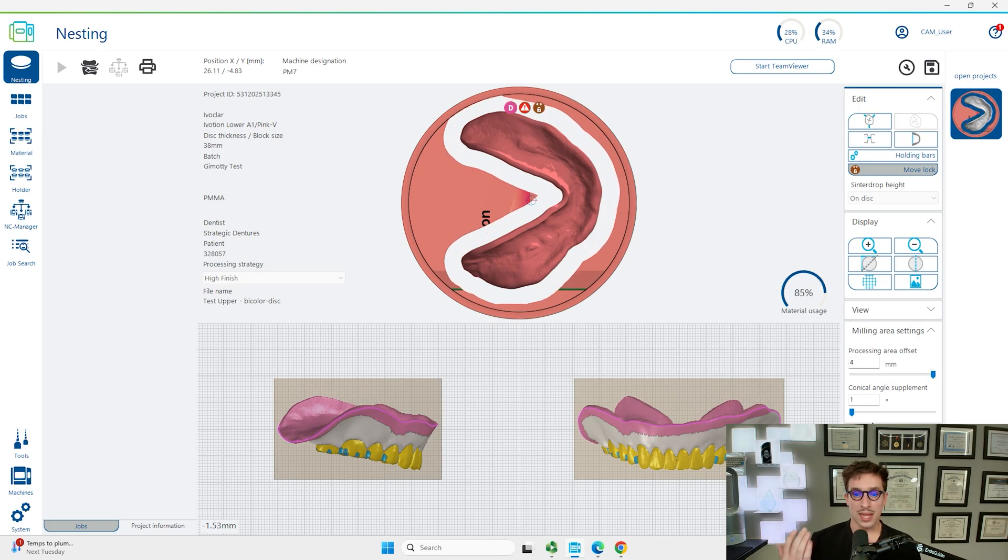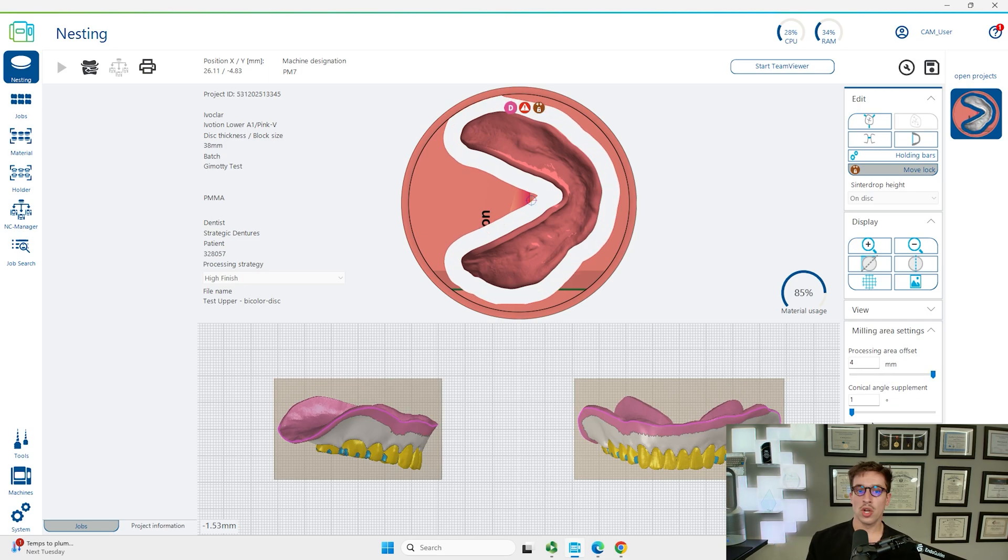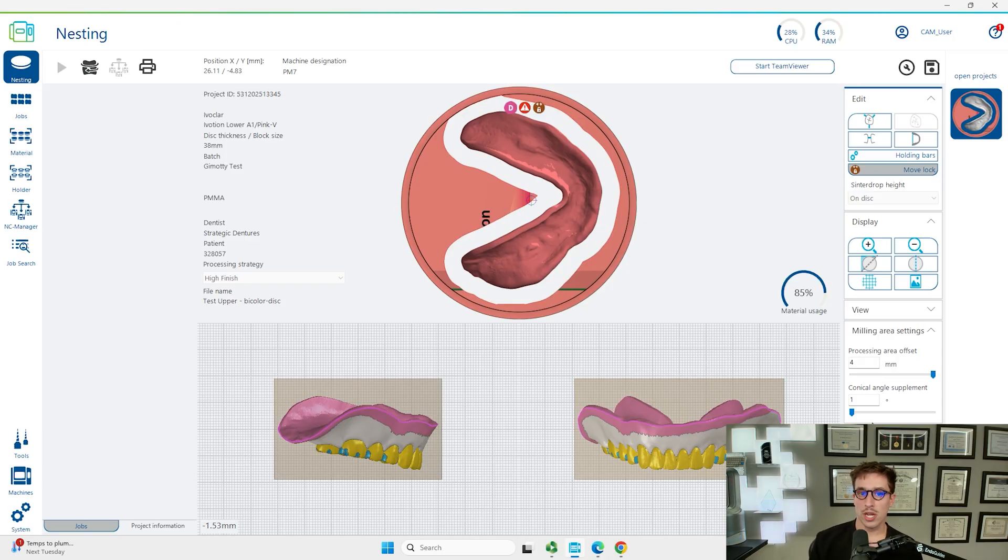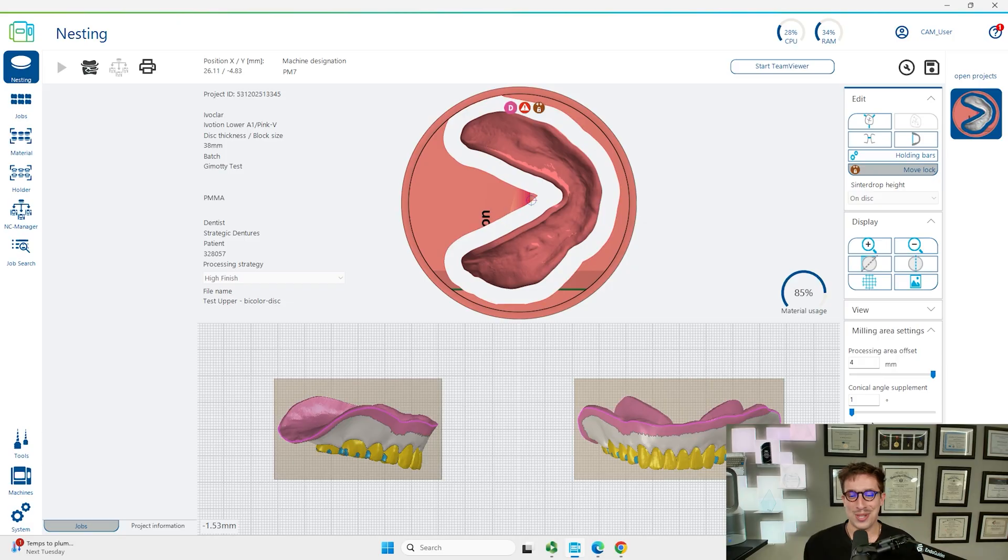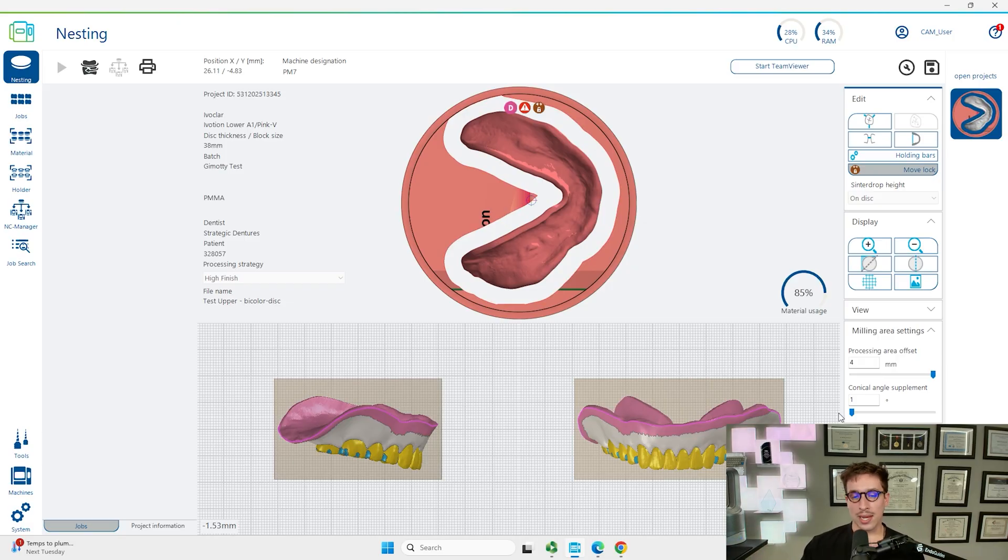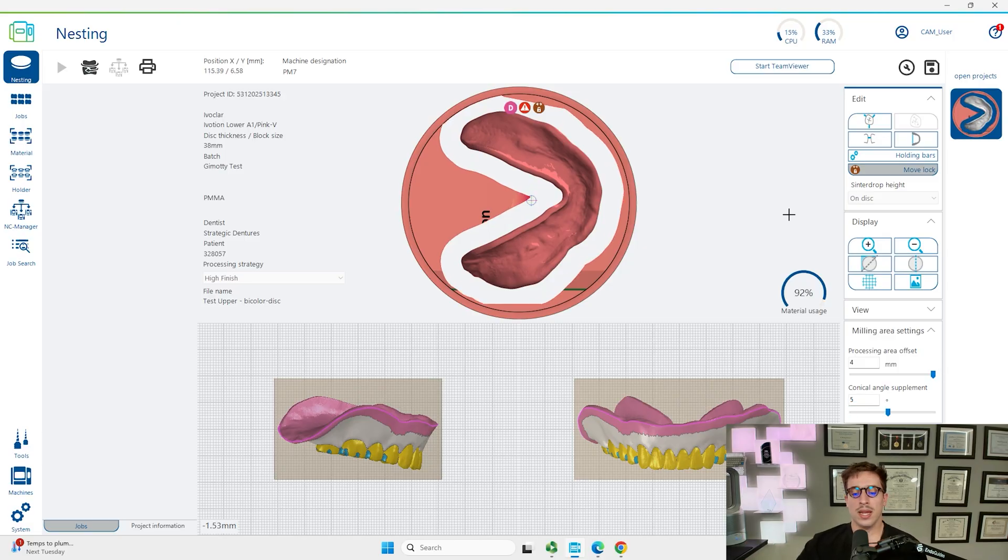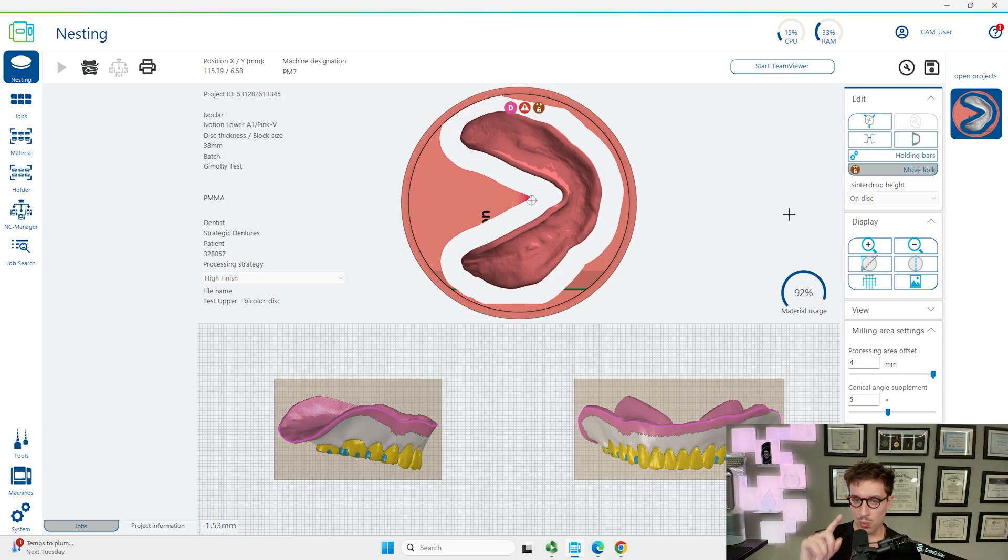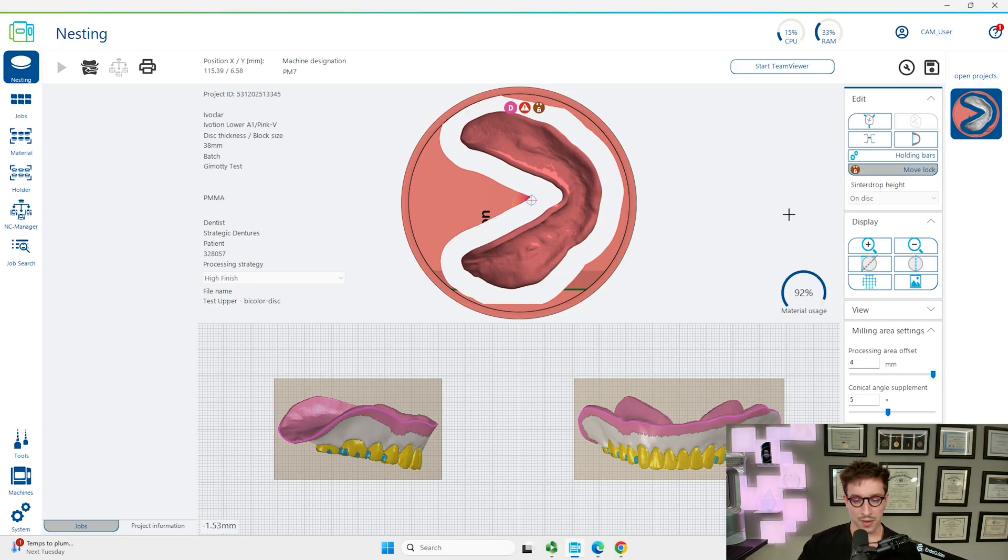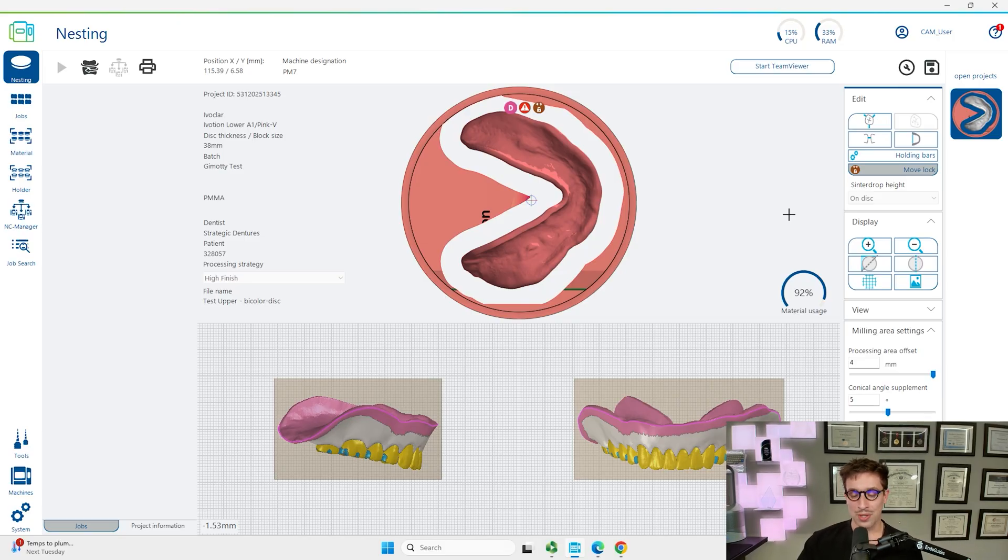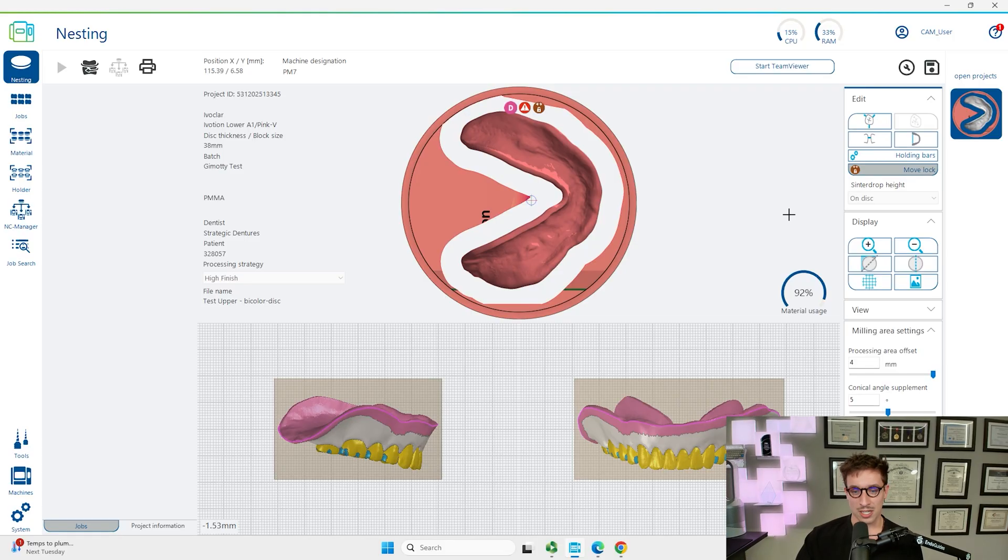We've automatically nested it here for this mandibular denture. I'm actually going to right click on the denture itself. There's two settings we have to change under milling area settings. Processing area offset and conical angle supplement. Processing area offset, we're going to put that all the way up to four. A lot of times you can get it to be smaller if you're using a zirconia block, but you can't do anything else with these pucks after you've milled a complete denture on them.